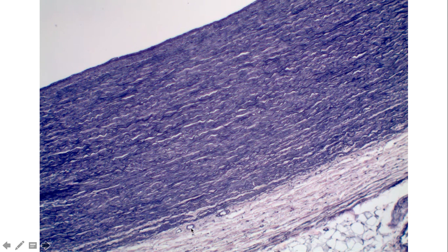Now, sometimes you'll look at a view and you may find prominent vessels out here. These vessels are not part of the aorta. This is just the surrounding adipose tissue and connective tissue. So you want to make sure that you're looking within the tunica externa. And so these vessels that you find just inside the tunica externa, these are going to be those vasa vasorum. So don't look for vessels outside the tunica externa. Those are just going to be other vessels related to the surrounding connective tissue.